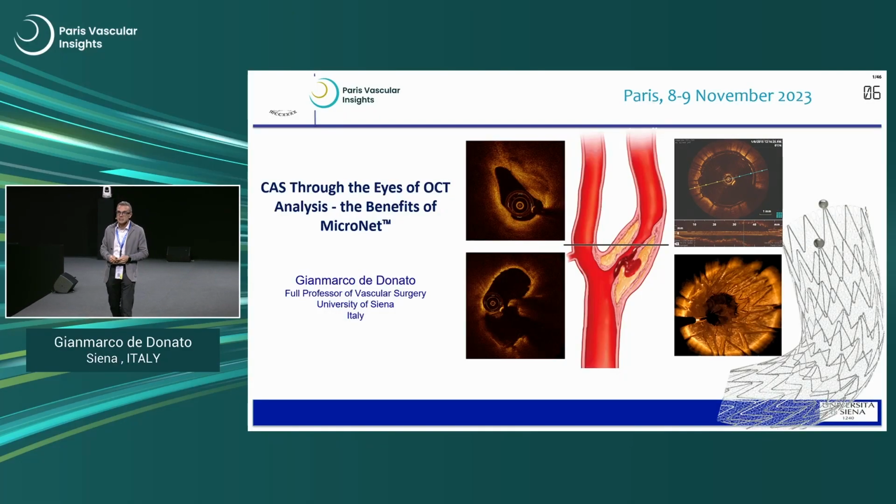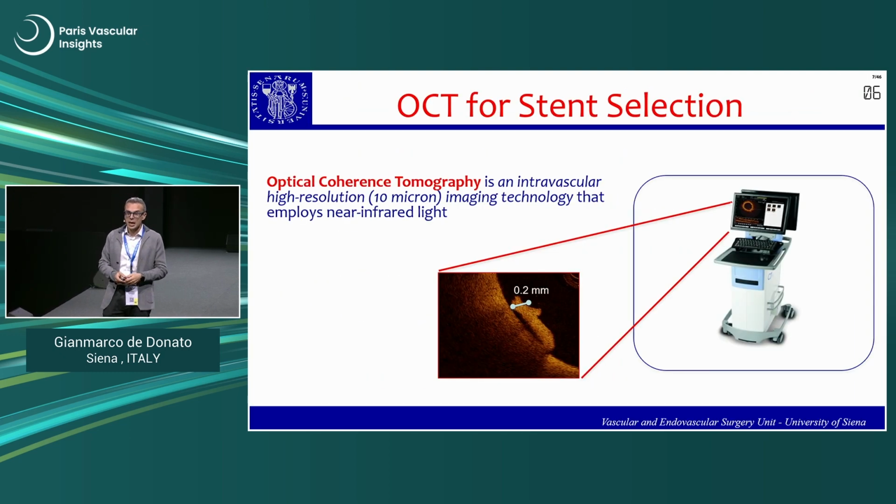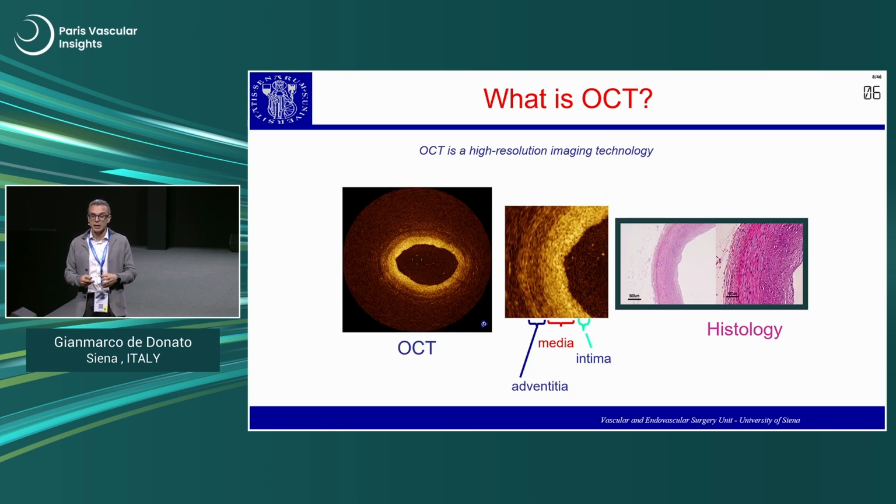My experience with the optical coherence tomography in carotids and even to show the benefit of MicroNet. So here are my disclosures. And what is OCT? OCT is an intravascular high-resolution imaging technology.